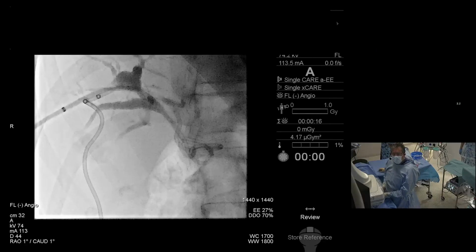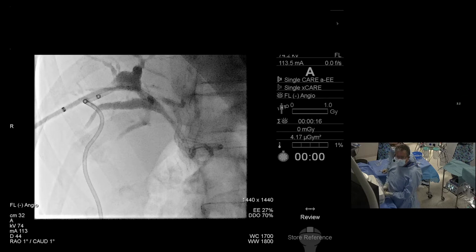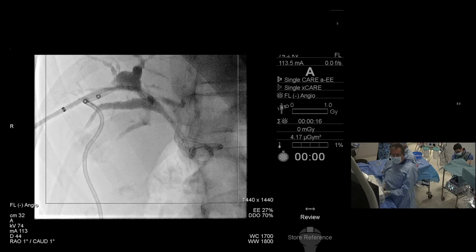Okay, so this is an interesting case of a chap in his 60s who has had two previous malignancies, a cholangiocarcinoma and also resection of a colorectal cancer. He has had a left hepatectomy for the cholangiocarcinoma and has re-presented with biliary obstruction because of previous surgery, including hepaticojejunostomy. He does not have a conventional endoscopic approach to accessing his biliary tree, and so he has had two right-sided internal-external biliary drains inserted.